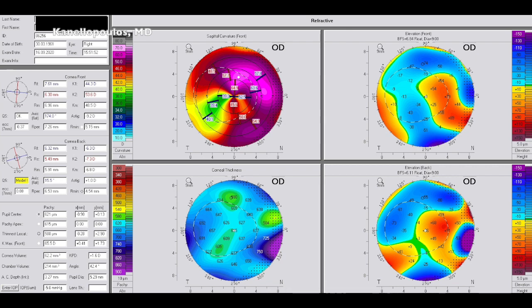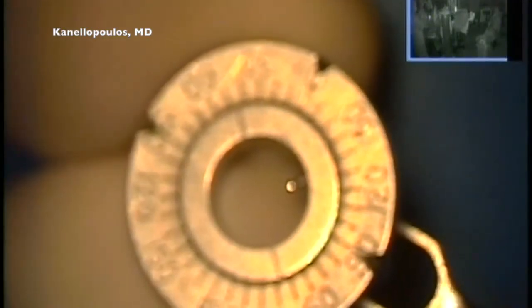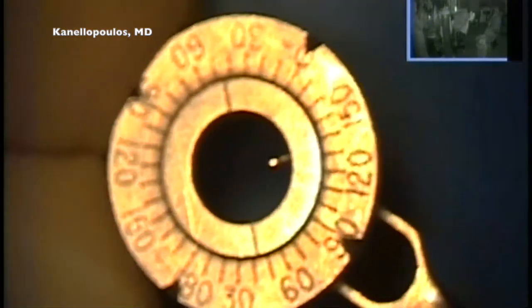These are the Pentacam images. As you can see, the cornea is very irregular. The key thing here is — what we've decided — to use a 3mm Pentacam total cornea keratometry, the amount of cylinder and axis, and use a toric lens. The key thing is to see how the keratometry changes depending on how far from the center we go, as this dramatically changes the power of the lens. So we opted to go with a 3mm keratometry.